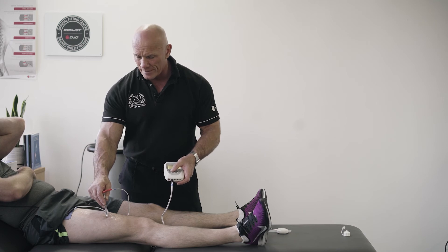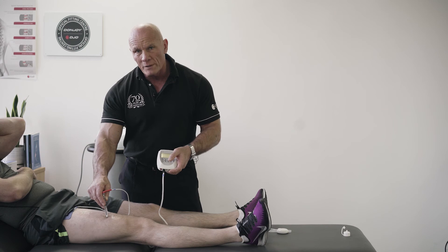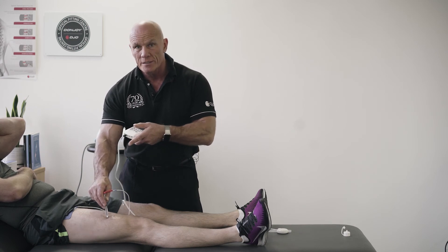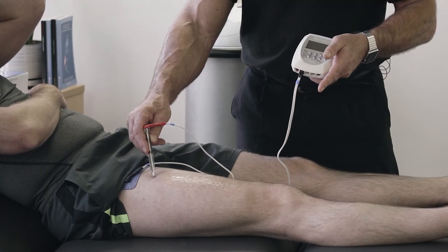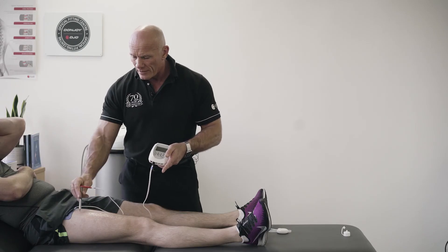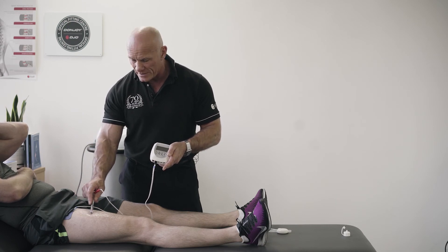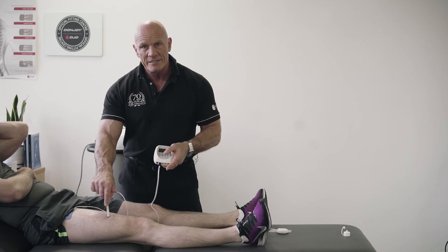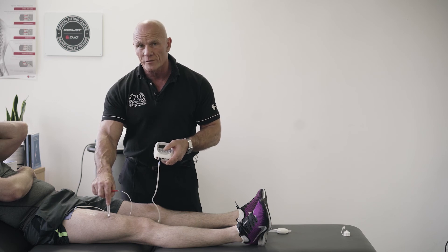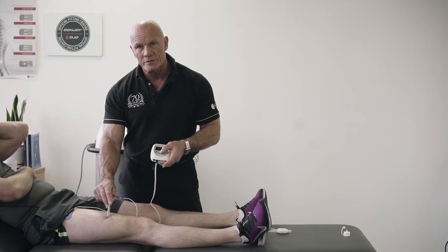If you read the anatomy books, they would tell you that the motor point will normally occur at the junction of the superior third to the distal two-thirds of the muscle, so I would have expected it to be here. Had I placed the electrode there, the impulse would have to travel through this very sensitive material called skin to get to the motor point and into the muscle — hence it will not feel comfortable for the patient. So if you use muscle stim and patients find it uncomfortable, it's likely because you haven't got the electrode over the motor point.